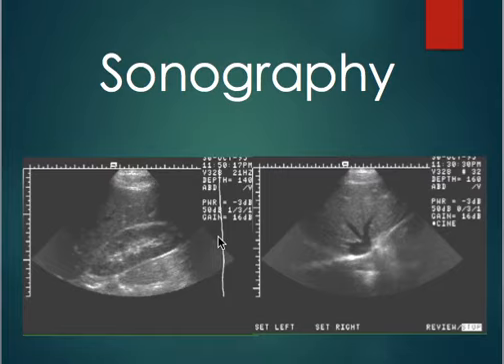So it can visualize real-time images where you can see actual movement within the organs or blood vessels, the fetus, or tendons.